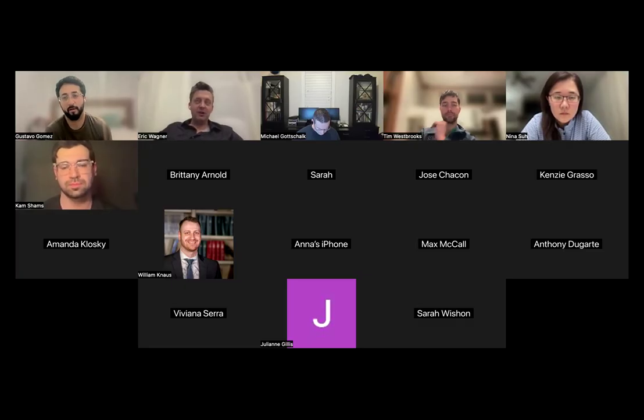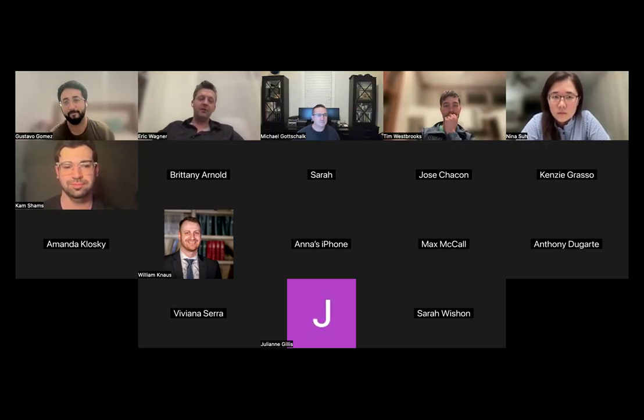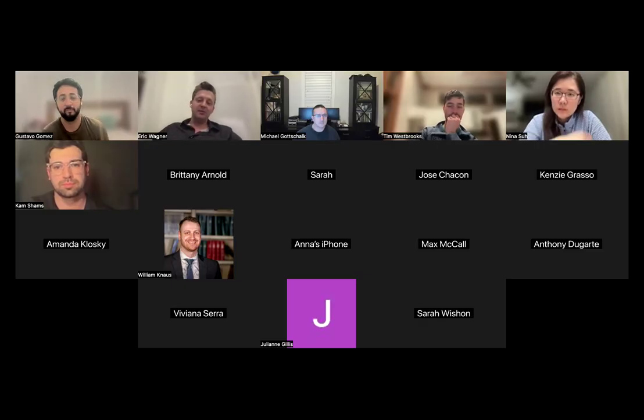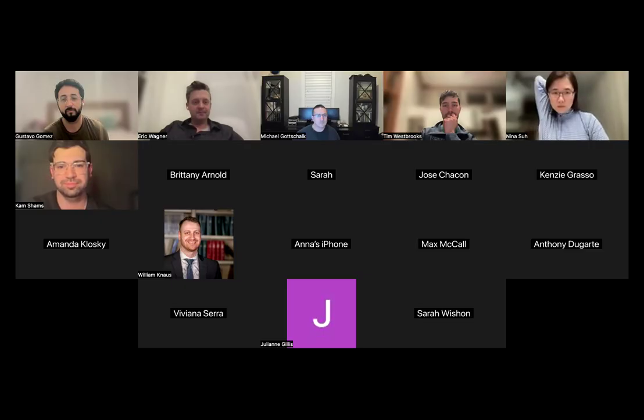My point is, if you're only going to scope the really, really hard ones, your whole system is going to have a lot of challenge doing it. Your scrub techs aren't going to be able to do it. It's going to take forever to set up. The equipment's not going to be right. It's going to be a total cluster. If you really want to do this, you have to scope everything for your own learning curve and your center's learning curve. And then it becomes expedient. Then it doesn't add much time. So it's really something you have to jump in with both feet or don't do, at least in my mind.